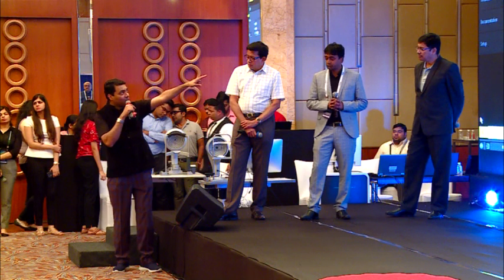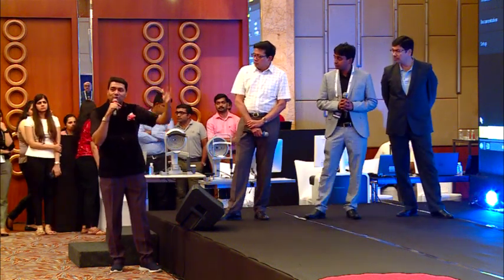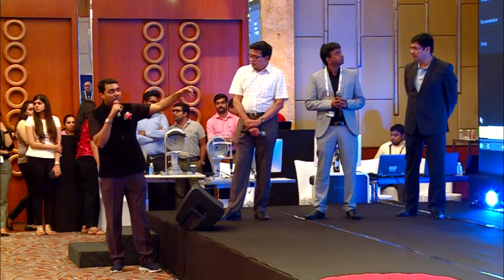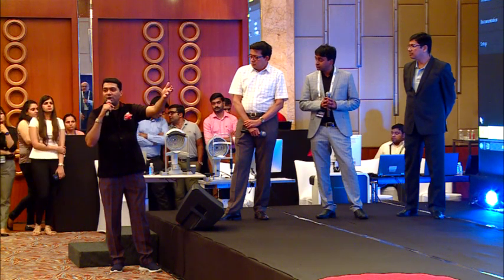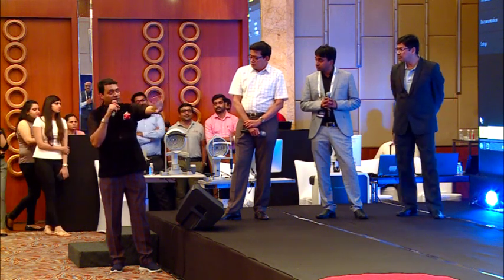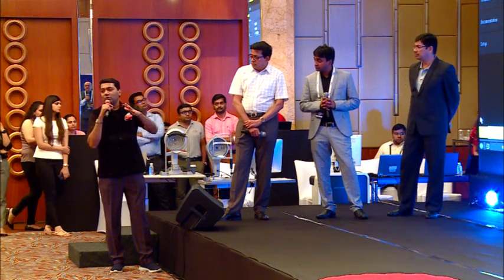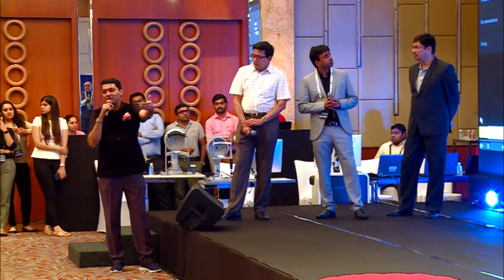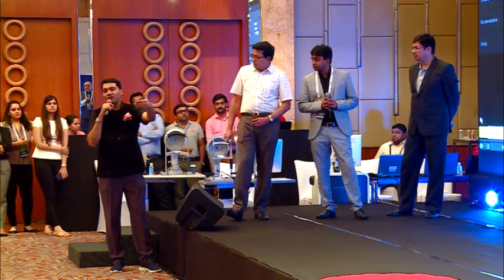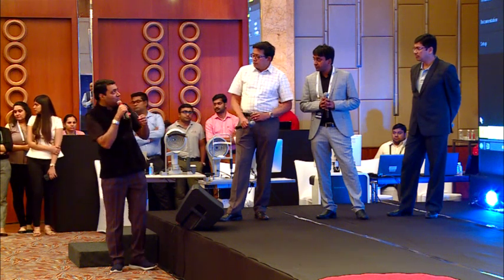So that's one of the reasons in these kind of patients, the earlier thought process was just ignore it, go back to wavefront optimized. The patient may come back to you tomorrow seeing 20/20, but he may have just a 0.75 or 0.5 cylinder. That 0.5 cylinder is filled with all kinds of unwanted aberrations. So the patient is not going to be very happy, especially if he's a computer user, because he'll not have depth of focus. And if you don't have depth of focus, they keep having headache, strain, migraine, night vision problems, multiple things. So that is the answer.